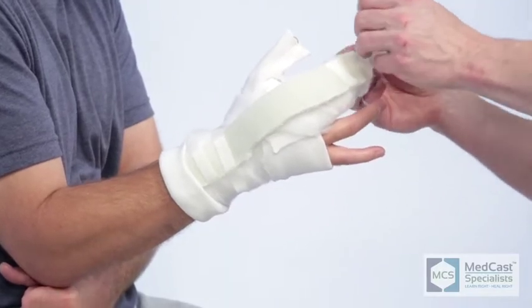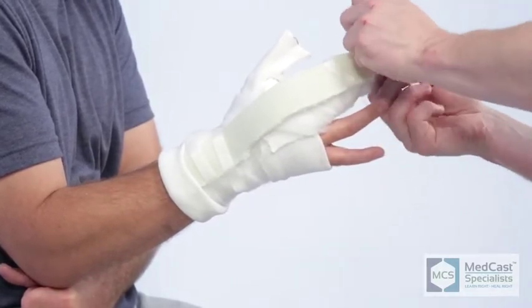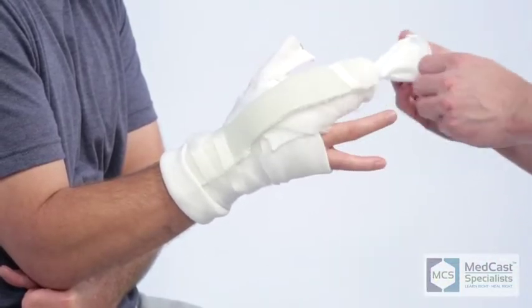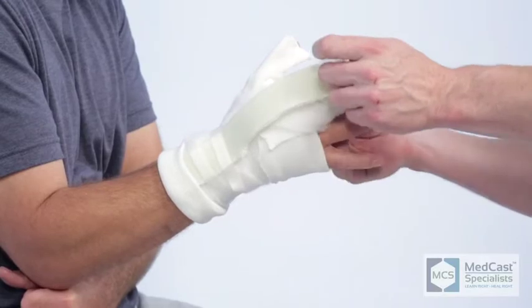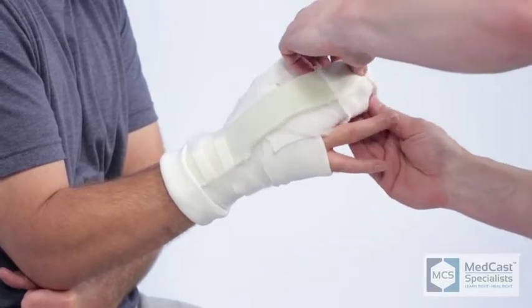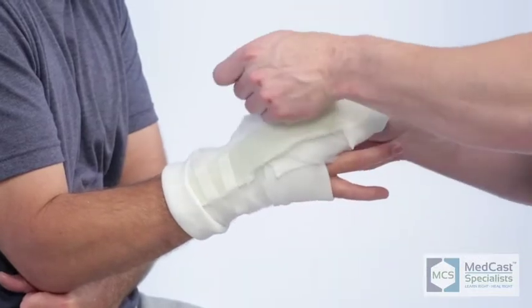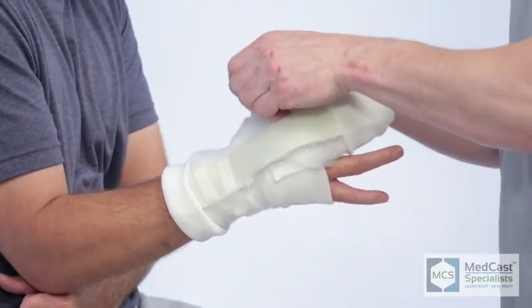For the stockinette on the distal end of the digits, you can twist the stockinette a few times, and that will eliminate anything getting down inside the cast. Sometimes we will cast patients that have pins in their fingers, and they appreciate the twist because it will keep debris and dirt from getting down inside of there and keep the pin sites clean.